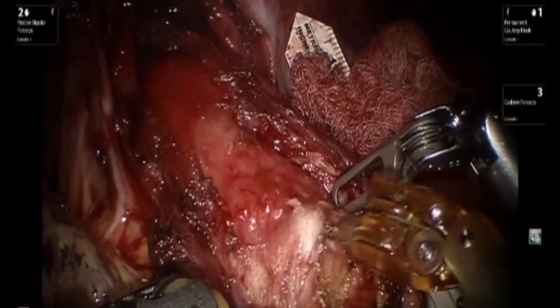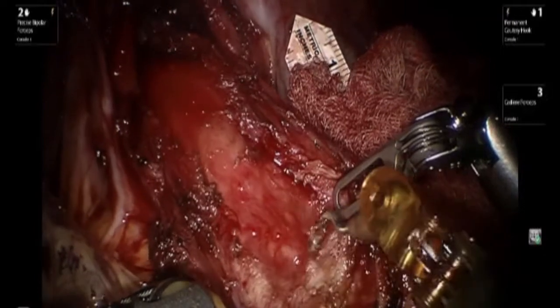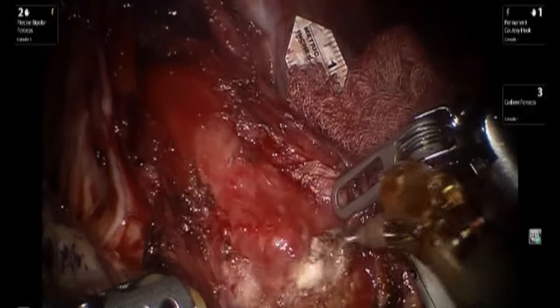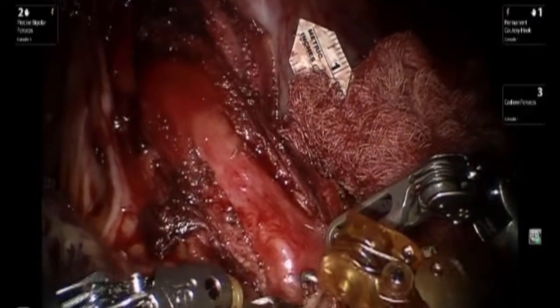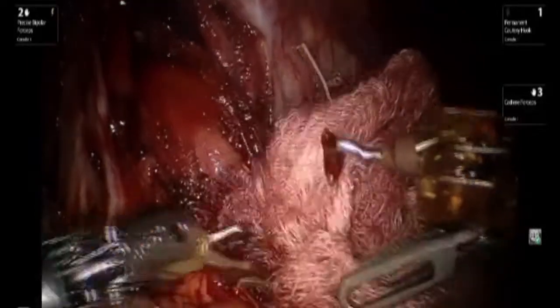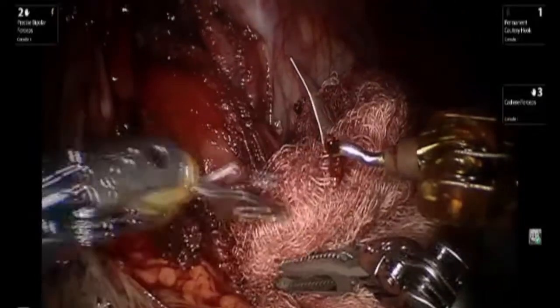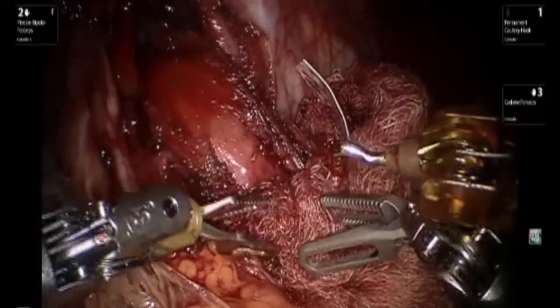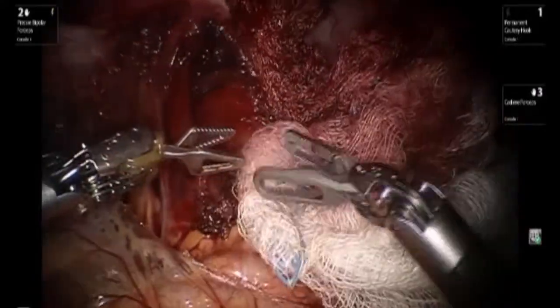It is convenient utilizing the robot, as one has excellent maneuverability just like you would with open surgery using your hand. Any small amount of bleeding encountered along the mucosa is best handled by application of gauze instead of using cautery and risking burning the mucosa with a subsequent perforation a few days later.